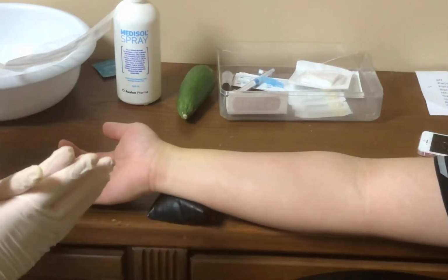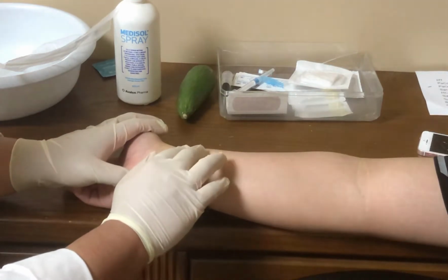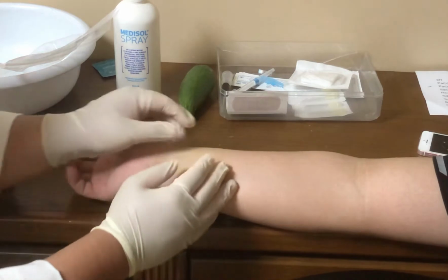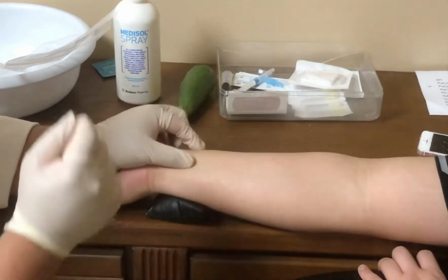So now, we need to locate the pulsating artery. It is here. And we need to stabilize it by pulling on the skin and creating a bracket of it with a free hand, because this is the free hand and this is the puncturing hand.